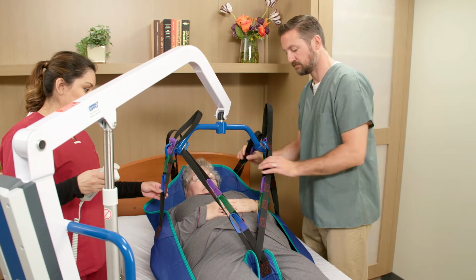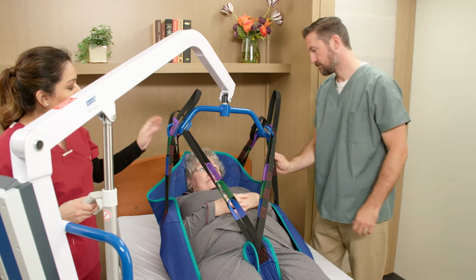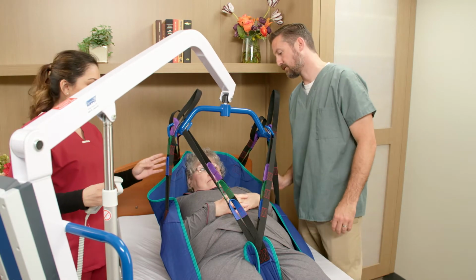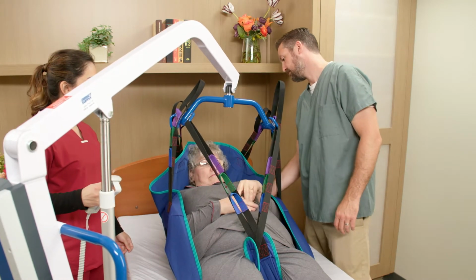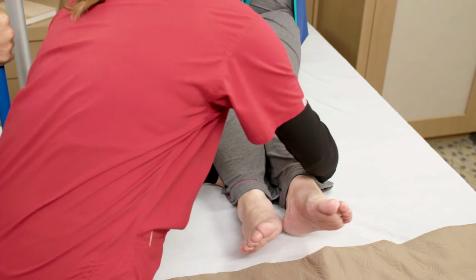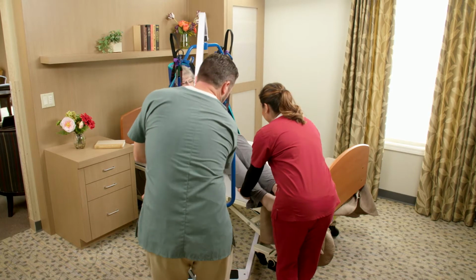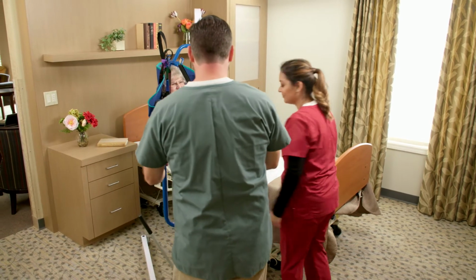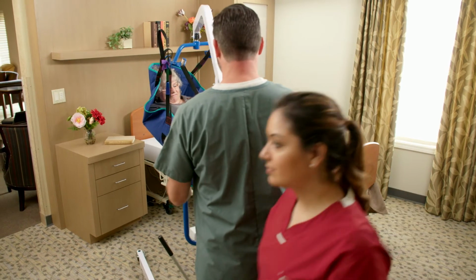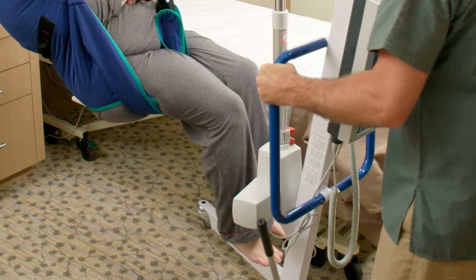After elevating the resident a few inches above the bed, ensure the sling and all attachments are secure and properly connected. The resident's weight will be fully supported by the lift. When the resident is clear of the bed surface, swing the resident's feet off the bed. Please use caution during this step. If the resident is not clear of the bed surface, it could result in shearing or friction on the resident's skin. Use the steering handle to move the lift away from the bed.